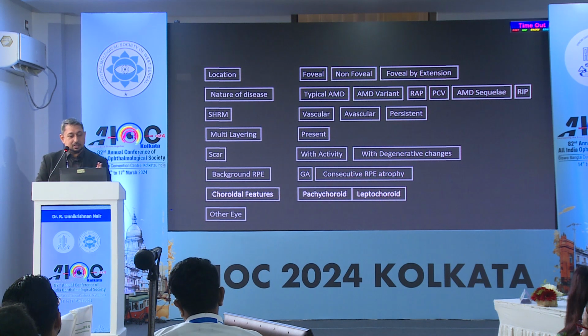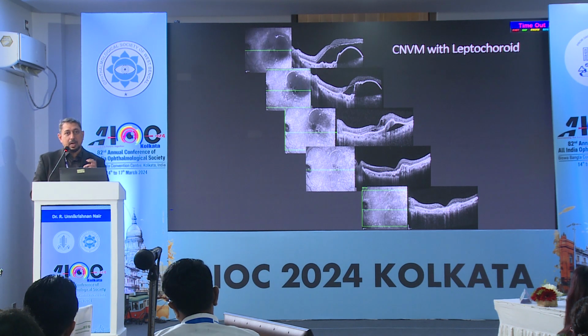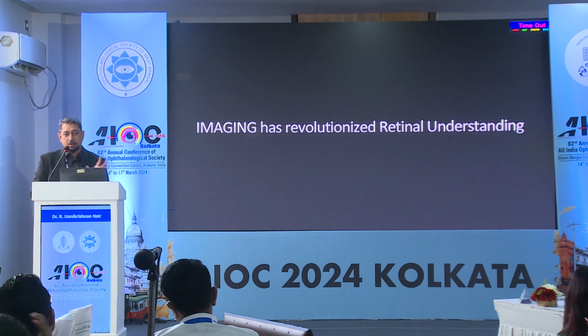The choroidal features. Some of the leptochoroids are the most dangerous diseases to treat because they go into atrophy extremely fast. So identifying a thin choroid, a leptochoroid CNVM is very, very important. So all these features are imaging-based features, diagnostic, prognostic. It gives you features to say things.